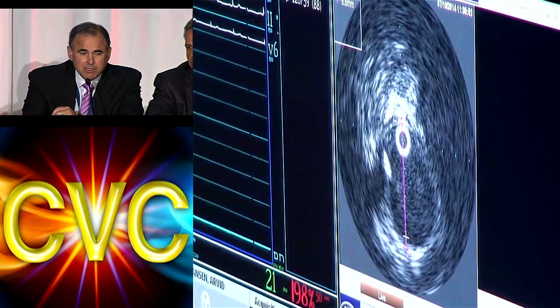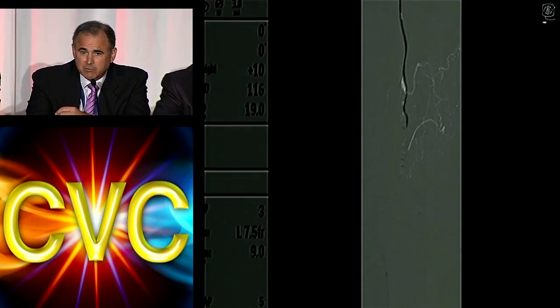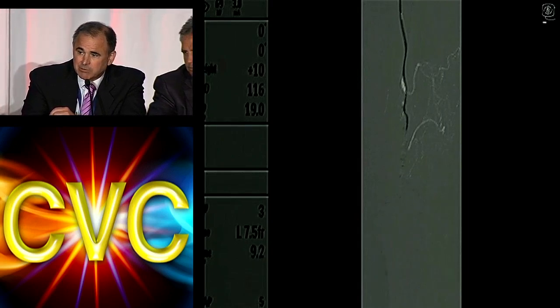I think that's very helpful, along with some of the CTO wires that we use. And actually, the device Tom just talked about would be very interesting here, because you truly can stay intraluminal. The problem here with perforations is not typically the popliteal itself, but you get into many of these small branches coming off, and you perforate there. That's potentially a problem.